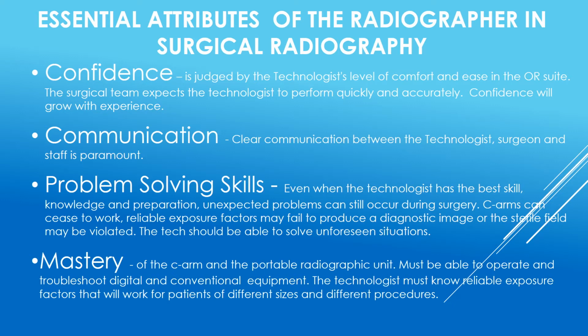Problem-solving skills. Even when the technologist has the best skill, knowledge, and preparation, unexpected problems can still occur during surgery. The C-arm can cease to work, reliable exposure factors may fail to produce diagnostic images, or maybe the sterile field may be violated. The tech should be able to solve unforeseen situations.